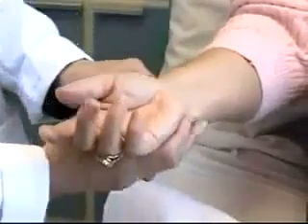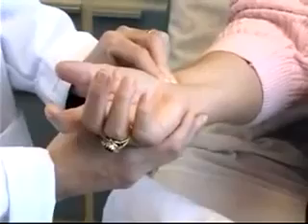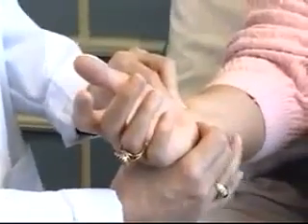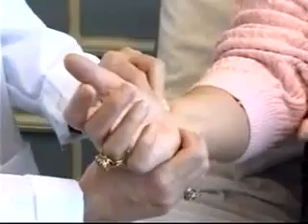The Allen's test is performed as follows. First, I'm going to palpate with my fingers the radial artery. Next, I'm going to palpate the ulnar artery again with my fingers. If I can't feel the ulnar artery, I'm going to palpate the area closest to where I think it would be located.